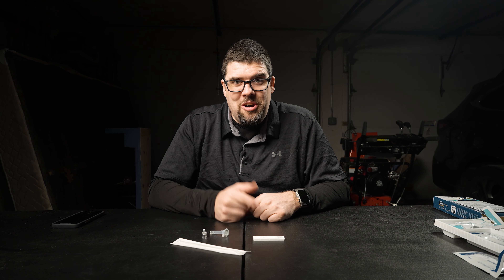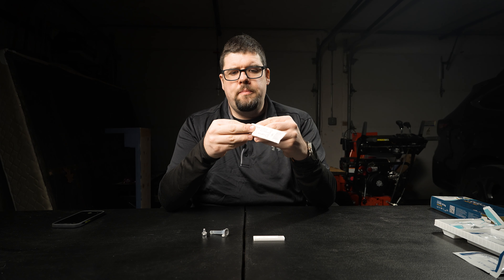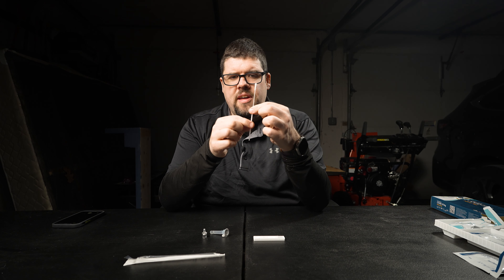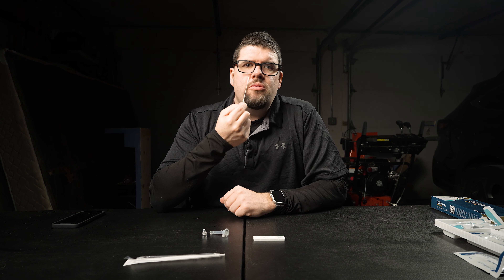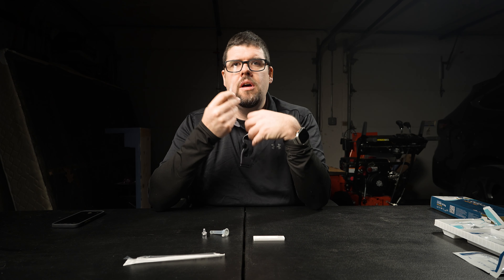With these three items, it's going to be simple. So you can go and hang out and do nothing the rest of the night because you feel like crap because you have COVID-19 — that's why you're watching this video, right? So we're going to take our swab and open it up. The swab is very different — it's thick and thin. There's a line here, that's where they want you to hold it. Put your index finger there and hold it. I'm going to put this about a half inch to three quarters of an inch in my nose, and I'm going to go around five times while blowing out, to get as much nasal stuff down and onto this swab.